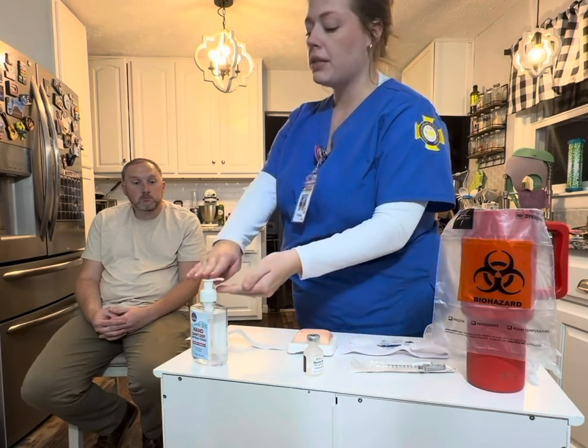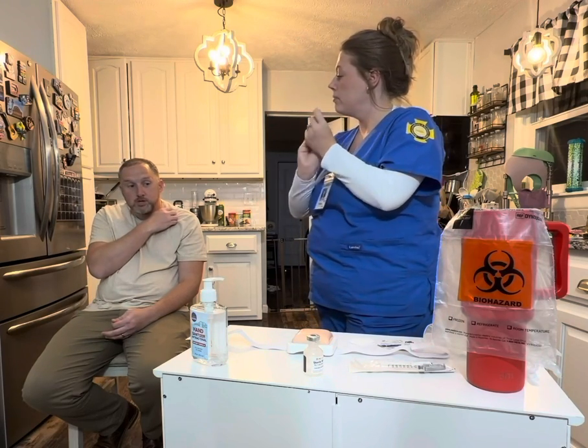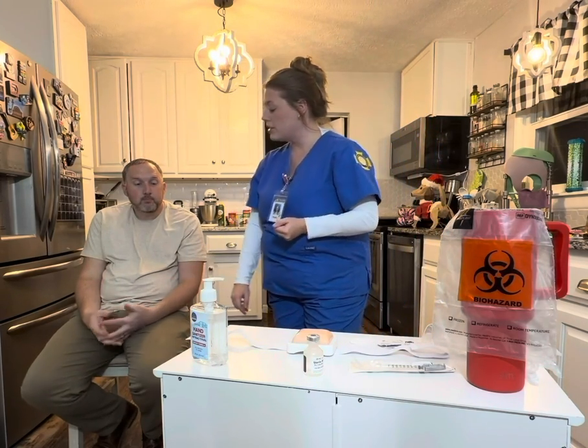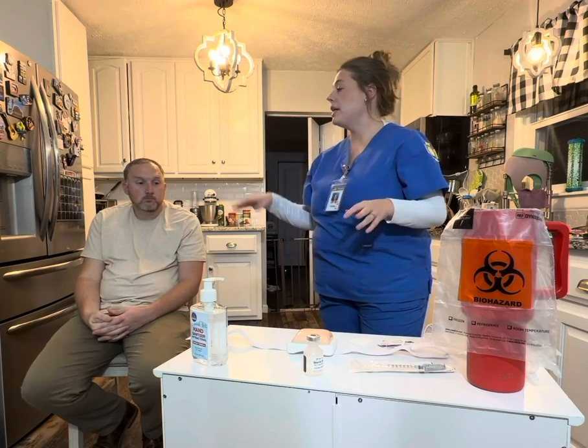Hello, my name is Paisley. I'm going to be the nurse taking care of you. Can I get your name and date of birth? Jared Robinson, 7/31/87. Thank you. I will go ahead and check that against the wristband. Make sure it matches. It does. Do you have any allergies? No. Okay. Then from here I would go ahead and perform any necessary assessment that was needed before giving any kind of injection.